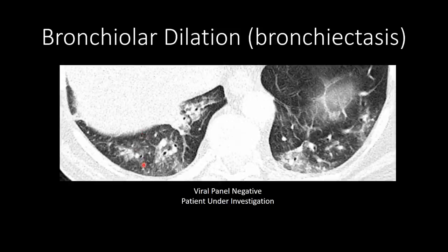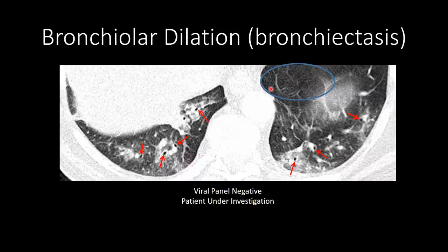Another finding being reported is bronchiolar dilation in the region of pulmonary abnormality. We have areas of ground glass opacity that are peripheral and starting to have superimposed consolidation. Notice the bronchi within these regions of airspace opacification are dilated and more prominent than in the part of the lung without ground glass or consolidation.